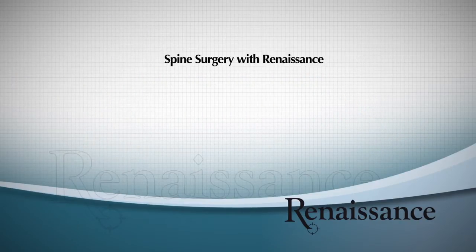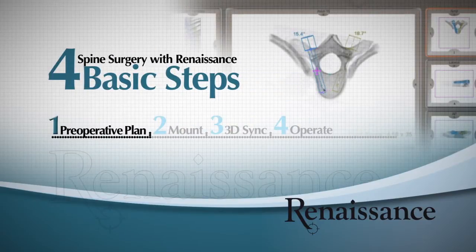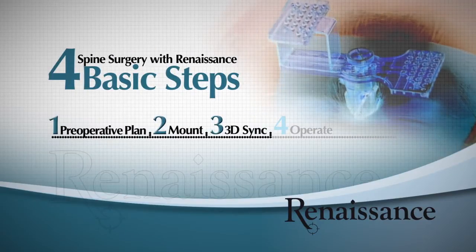Spine surgery with Renaissance consists of four basic steps: preoperative plan, mount, 3D sync, and operate.